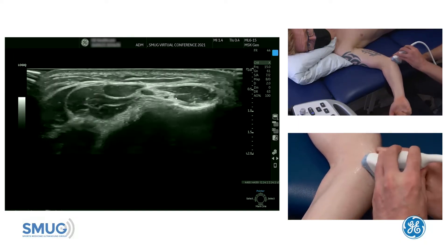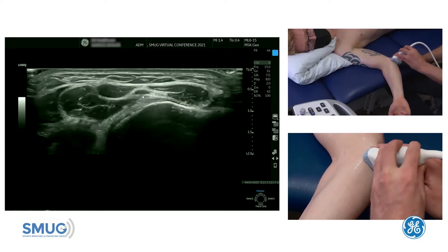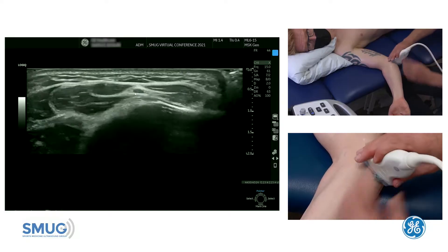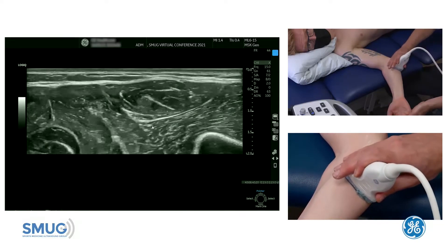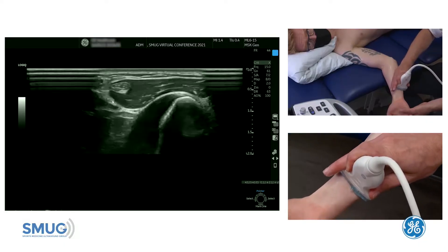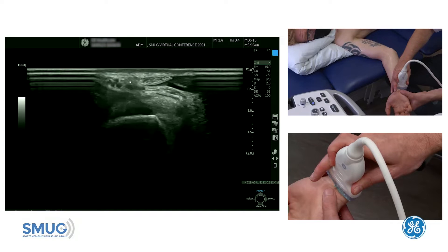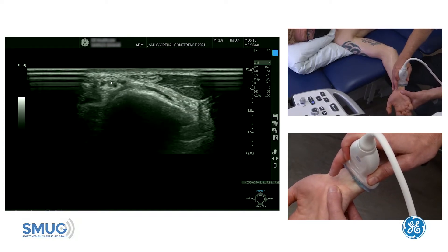In this case it doesn't do too much. As we follow it down, you can follow it until you see the two heads of flexor carpi ulnaris and the nerve in between the two heads, looking at that internal structure. Then obviously we can follow that nerve all the way down into the wrist into what we know as Guyon's canal, which is another region for entrapment, just next to the pisiform.